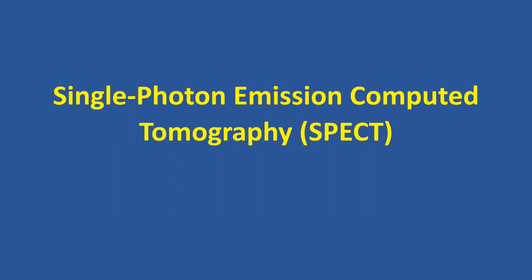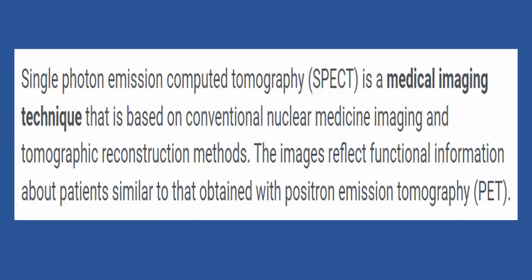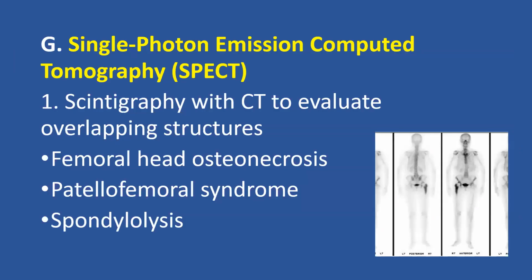Briefly about single photon emission tomography. The single photon emission computed tomography is a medical imaging technique that is based on conventional nuclear medicine imaging and tomographic reconstruction method. The images reflect functional information about patients, similar to that obtained with positron emission tomography.